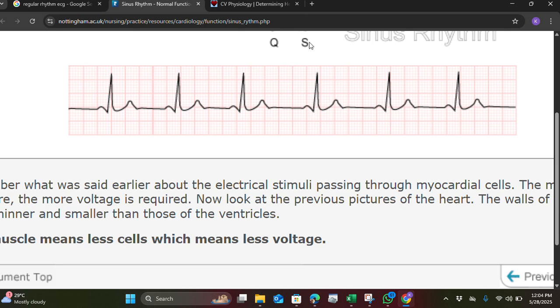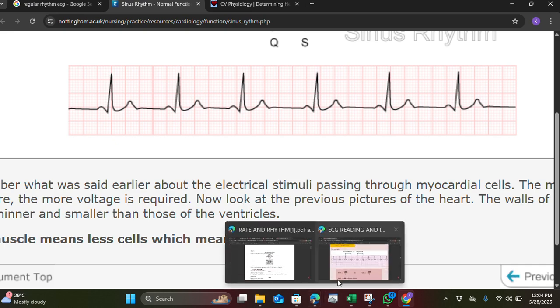28. So that's just going to be 1500 over what? Over 28. And then someone asked me how many decimal places you are going to round it up to. Then I said 2 decimal places. Or better still, you can round it up to the nearest whole number, since even the machine is going to report it in whole number. So you can just round to the whole number or 1 or 2 decimal places. So yeah, that's just all about calculating the rate if the reading is regular.